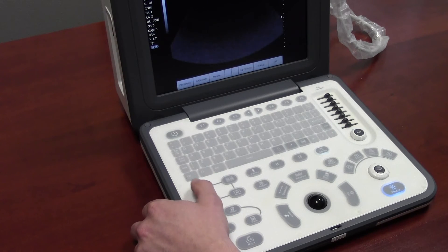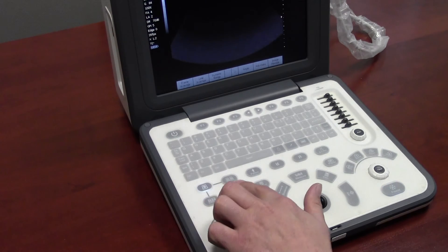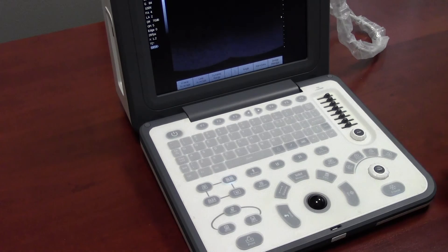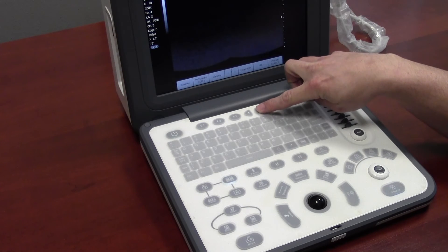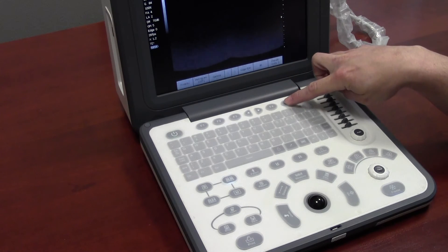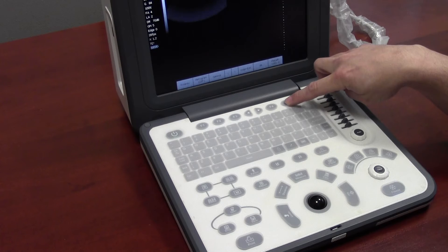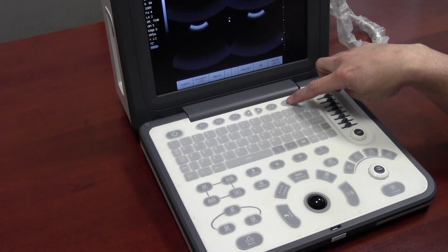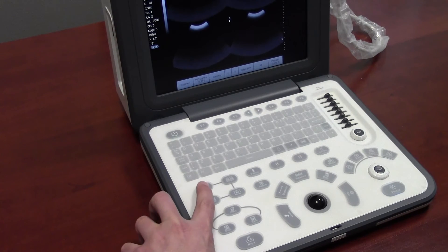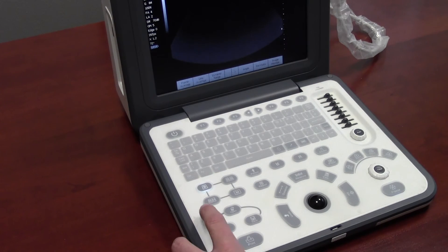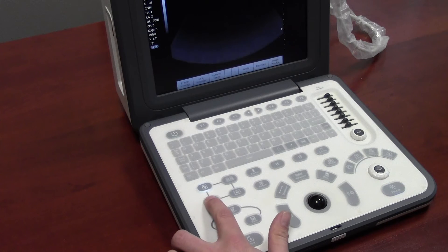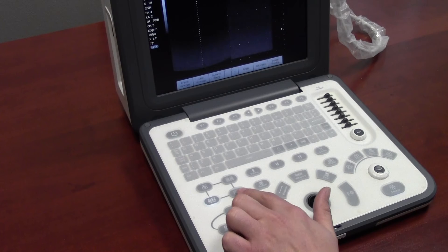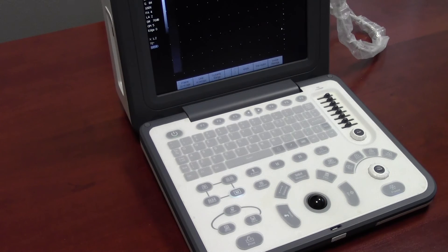These keys go through B mode and dual B mode. You can also go to quad B mode by pressing the right arrow key and pressing 4B — every time you press that 4B key, it will take a new image. Go back to single view by pressing the single B. You can share between B and M mode by pressing BM, or see single M mode by pressing the large M button.